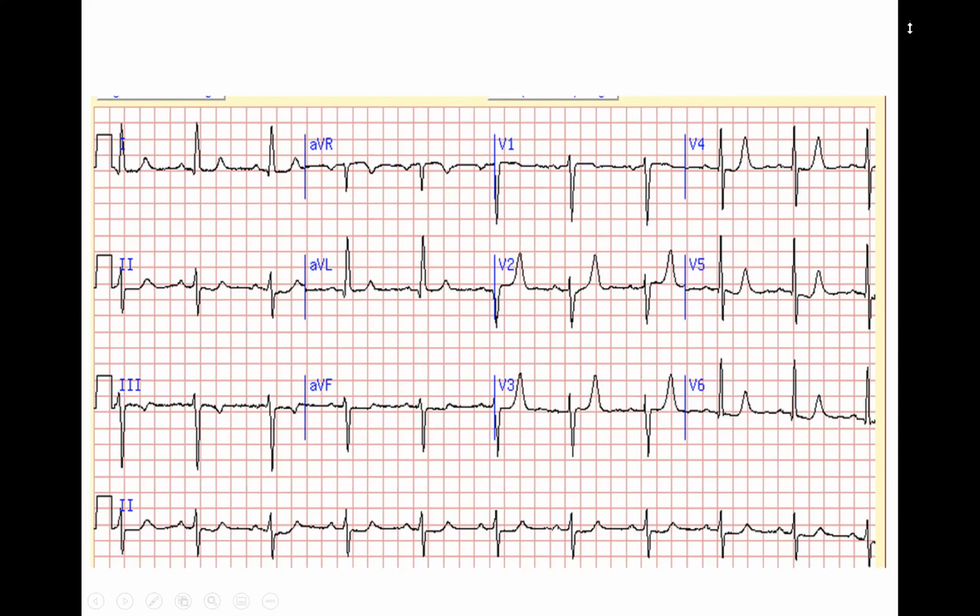No problem, Muawiyah. This is sinus rhythm. The QRS complex looks okay. The PR interval is okay. There are criteria of LVH: AVL is more than 11. The axis is left axis, and the T wave is a peaked, tented T wave, which goes with hyperkalemia. So in summary, it is sinus rhythm, LVH, and hyperkalemia. Excellent, thank you very much.